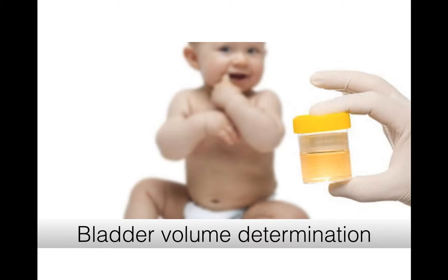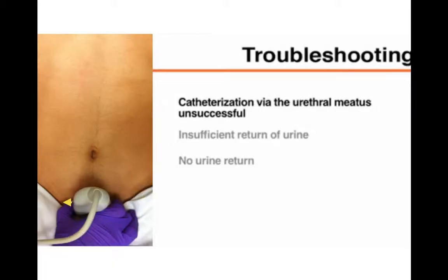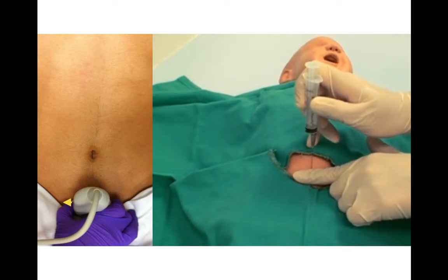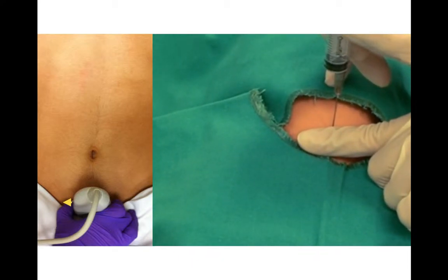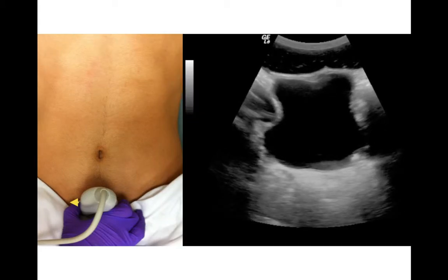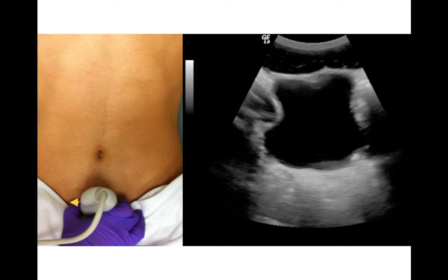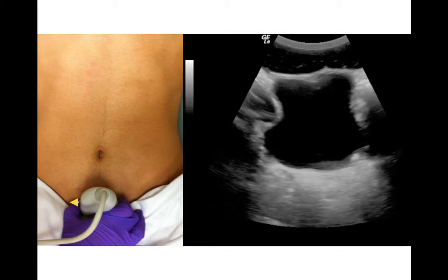So we need to define this. And for those smaller children or those difficult to place the catheter, sometimes you will do the suprapubic aspiration. If you can identify exactly the position of the bladder, it will be safer and more comfortable for you to do the suprapubic puncture. You don't need to do it in real time. If you want, you can, but most of the time we scan for the bladder to define, okay, it is a distended bladder. You mark the location, you do the puncture and aspiration. Okay, the job is done, everyone is happy.